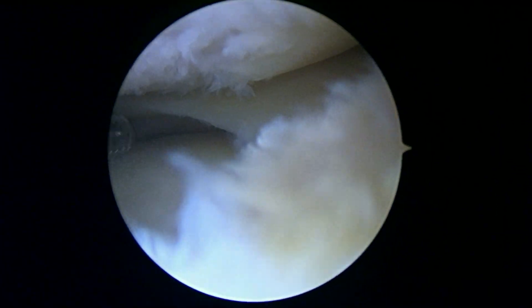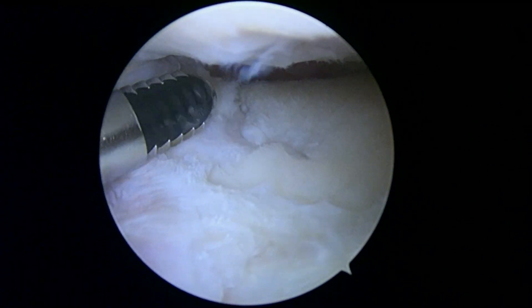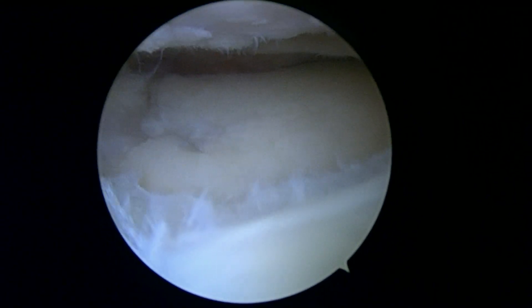I just wanted to show this so you know that you've still got a little bit of arthritis remaining in this lateral compartment. In terms of the meniscus, I think we're done. Next we'll take a look up at the patellofemoral joint.